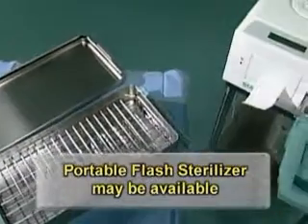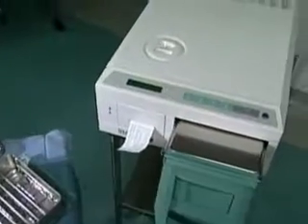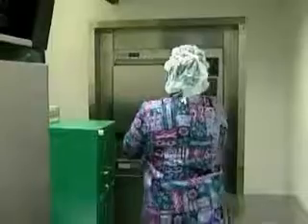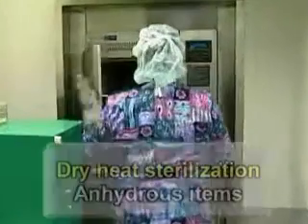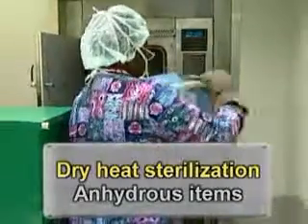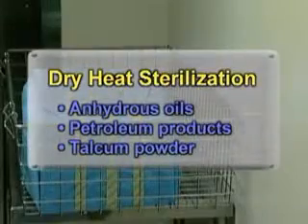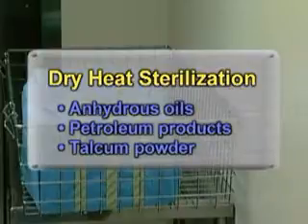There is now a commercially available portable flash sterilization unit. Dry heat sterilization is used primarily to sterilize anhydrous items that can withstand high temperatures, such as anhydrous oils, petroleum products, and talcum powder that steam and ethylene oxide gas cannot penetrate.